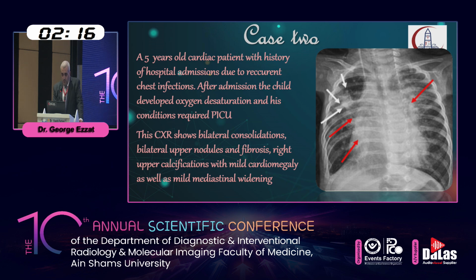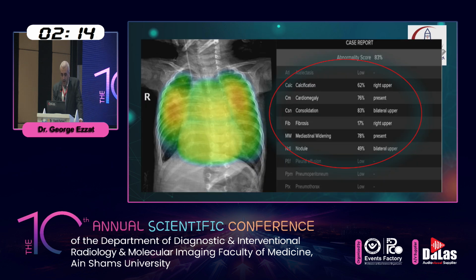This was a case with multiple findings, and actually the AI did well and picked up most of the findings. It showed the bilateral consolidations and the cardiomegaly and the reticulonodular densities, as well as the right upper zonal calcification.